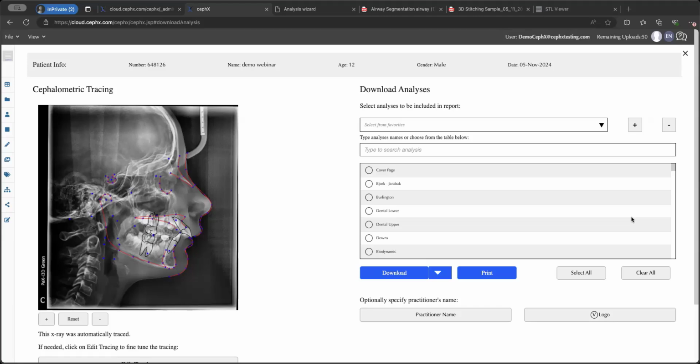Okay, so the demo DICOM is part of the trial package. We will send you a follow-up email with a link to sign up and get some free cases. You can upload a DICOM when you do that. And then the pricing is actually in a separate link that we'll send in that email as well. I don't know about other software that can provide this. Seg3D definitely doesn't do anything with the AI. It's kind of a manual thing.